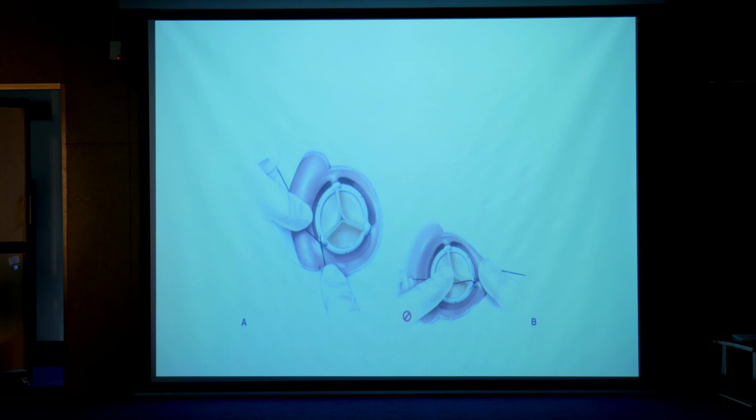And coming to the end step, but this is the most exhaustive step, aortotomy closure. This is initiated with 4-0 Prolene in a double layer at each end of the incision. The protective step is, you see here, we are taking a segment of the normal aorta in order to reinforce the aortotomy.